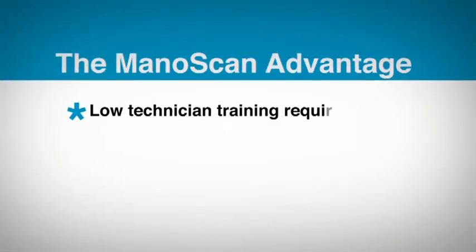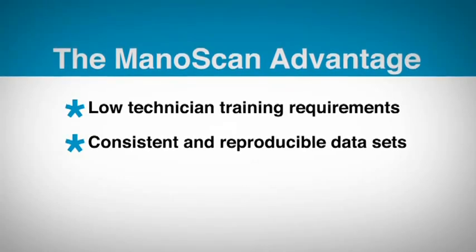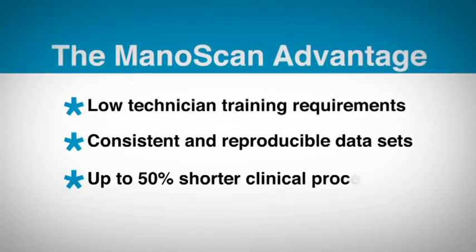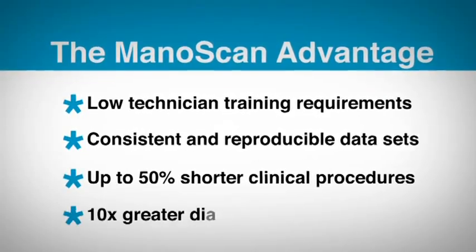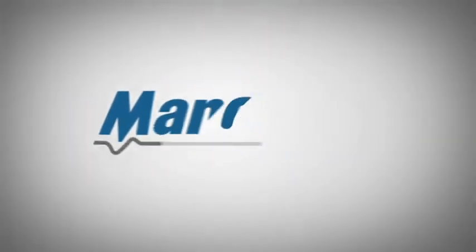Low technician training requirements. Consistent and reproducible data sets. Shortened clinical procedures. And nearly 10 times the diagnostic pressure information. That's the Manoscan advantage.